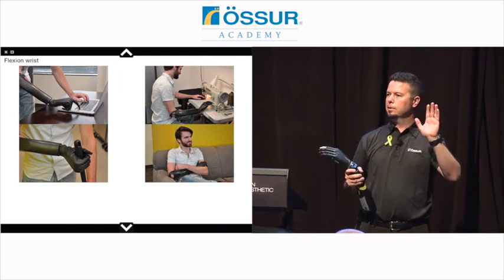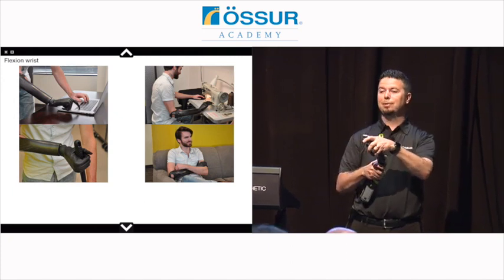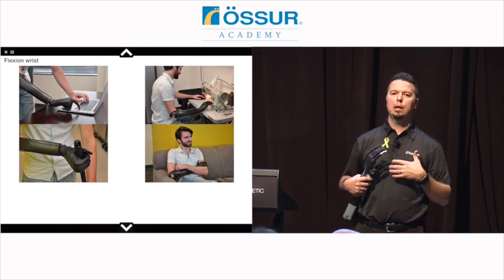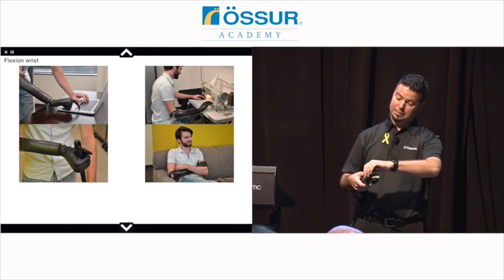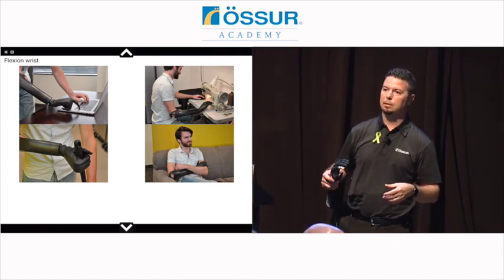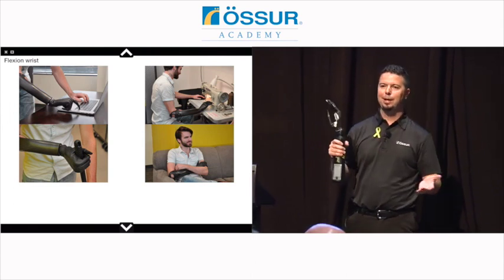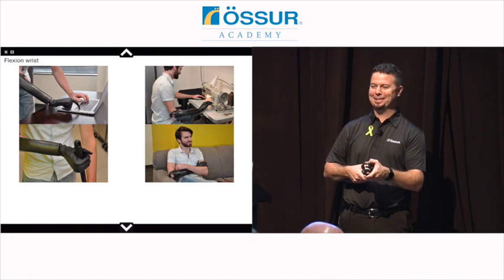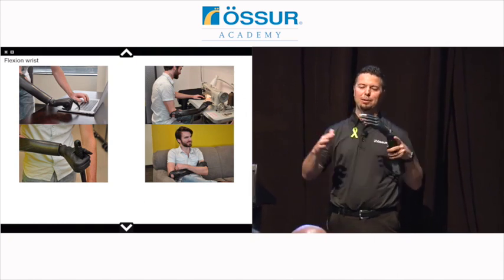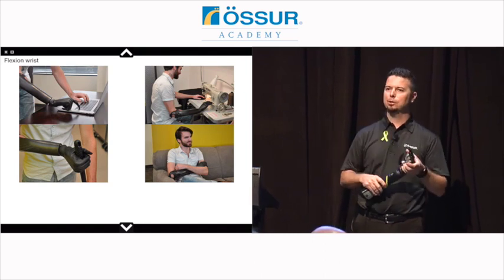Has anybody ever broken their wrist? So you can appreciate wrist motion. Very helpful, especially for bilateral individuals. Think about everything you do at midline. Very importantly, even toileting, hygiene. Think about that. I burnt my hand this summer, and I had to switch to my non-dominant hand to do that, and that is not easy. But you also need a lot of that wrist flexion to be able to achieve that. So for bilateral individuals, being able to reach midline with a lot less body English to do that.